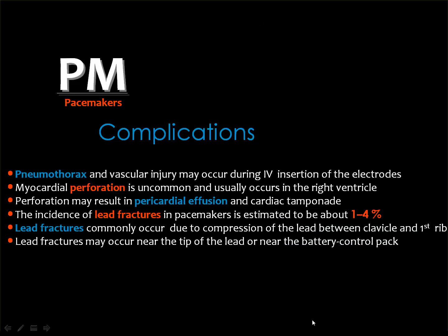Then the complications of pacemakers are like the previously mentioned with Swan-Ganz: the development of pneumothorax and vascular injury while inserting the electrodes. Myocardial perforation is uncommon, and the perforation may result in pericardial collection and the development of cardiac tamponade.